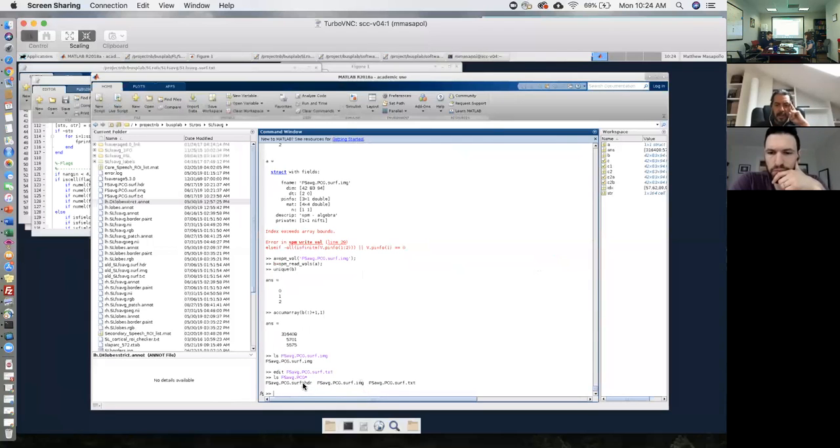there's an img and header file that corresponds to the analyze format where you're storing these files, and then an associated text file that contains the labels. And you can use this as a new ROI file in our pipeline and in any other software, and it will interpret it as basically containing two ROIs, one for the combined ventral and mid premotor and motor cortex regions for the left hemisphere, and another one for the same areas in the right hemisphere. Do you have any questions?